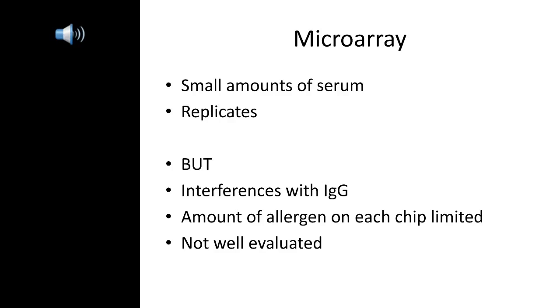And it's early days with microarray and pollen and aeroallergen component-resolved diagnostics, in that the clinical studies haven't been done sufficiently to be confident of them.